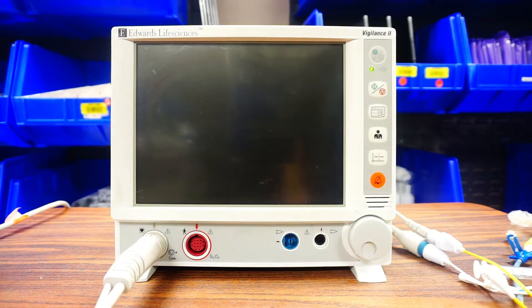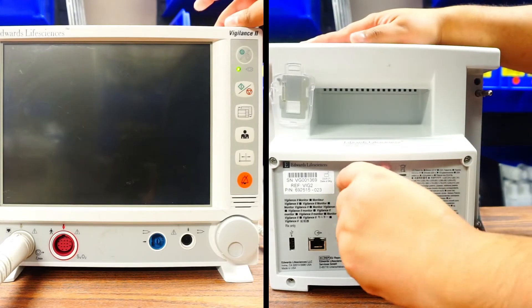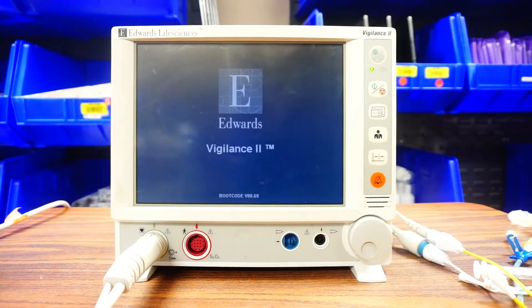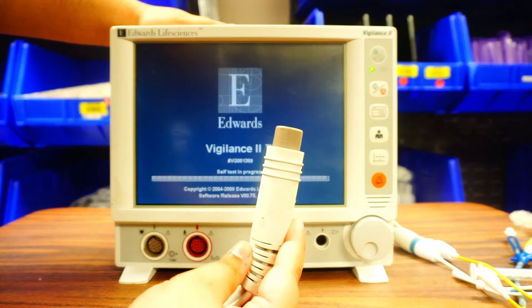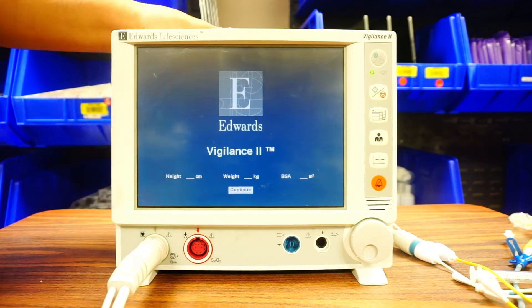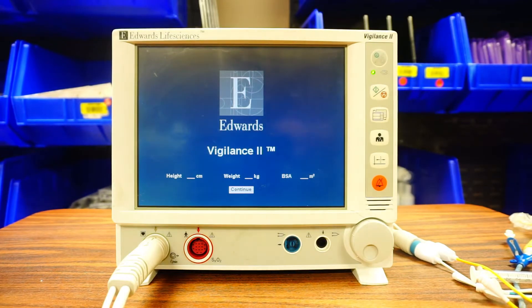We have two of these on the unit. The plug-in cord for your Vigilance 2 is going to be in the back. The button is going to be here, so go ahead and press that on. As far as cord connections, the same gray cord that we used for the Hemisphere is still here — I'm going to plug into the gray. We also have a red cord, similar to the Hemisphere, but the end of this cord will look different.